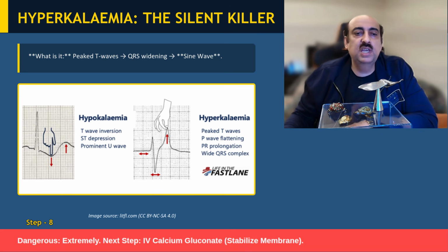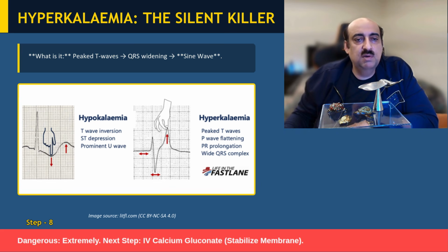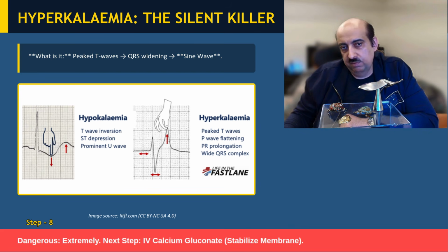And also hypokalemia, in which case you will have ST depression with T inversion plus a small upward deflection called a U wave, which we discussed previously. In any of these cases, especially in hyperkalemia, we need to be very careful because cardiac membrane stabilization is the first priority.